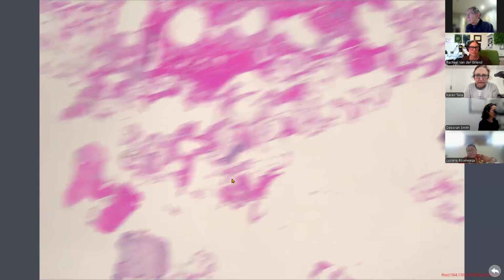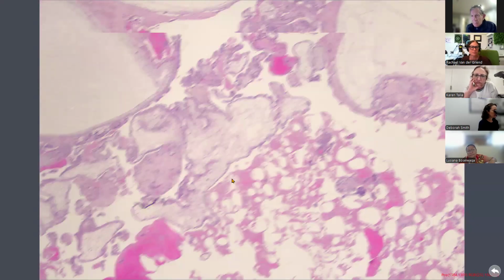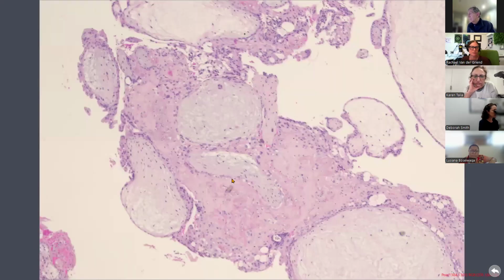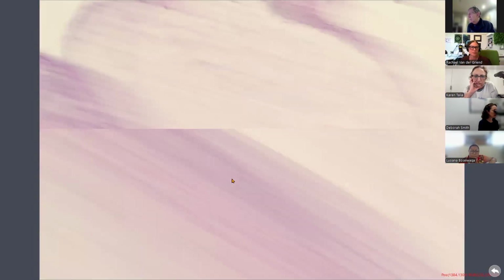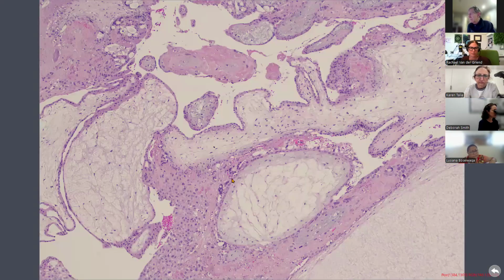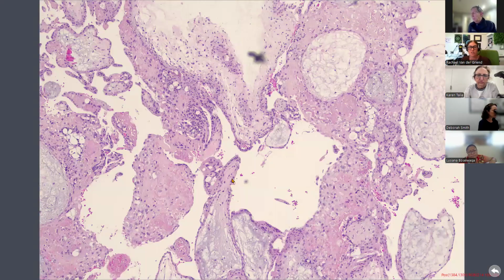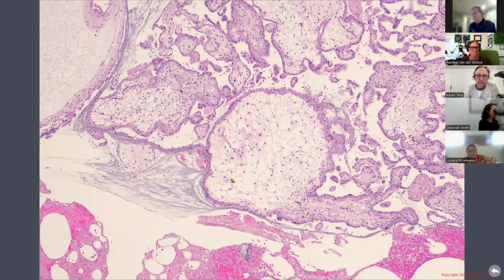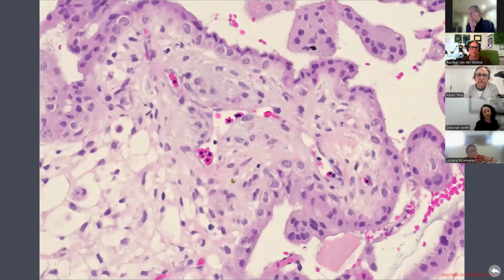We actually have a second specimen, which is also extremely degenerate. I believe we do have nucleated red blood cells, which also pushed us in the partial direction, but I'm not sure if I can find them now. There's not a lot, as you can see. And we have no further tests. Ultrasound's quite handy too. Was there a fetus? No. Oh, here. There we are. So this would be the other thing that would support a partial mole.